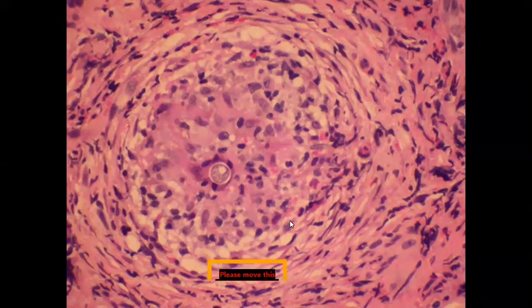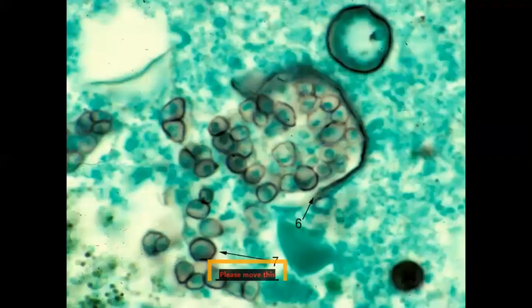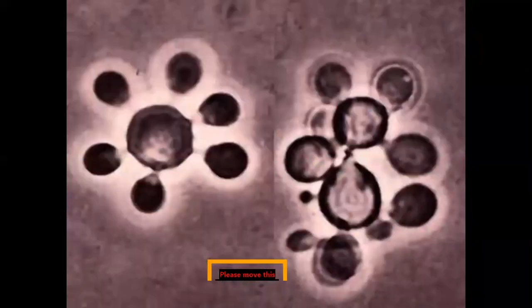So this is again one of the systemic fungi causing a chronic granulomatous infection. See this, this is a silver stain. So you have fungus. This is the membrane and a number of spores coming out of that ruptured membrane. So this is again a silver stain.